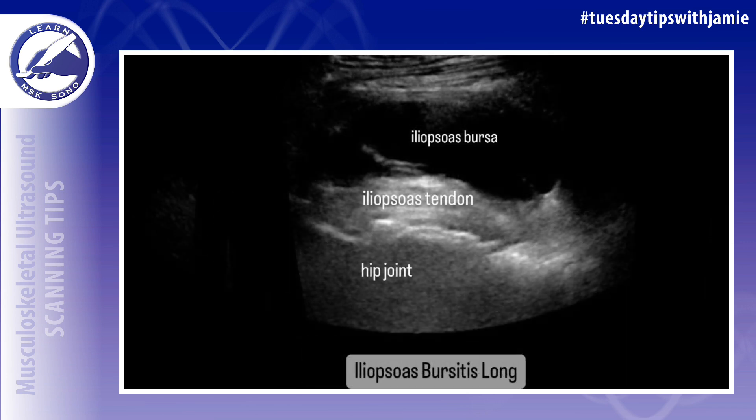When performing an MSK ultrasound exam of the anterior hip, the hip joint, iliopsoas tendon, and iliopsoas bursa should all be evaluated.